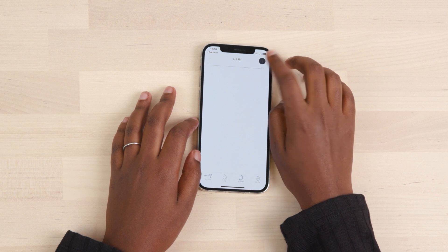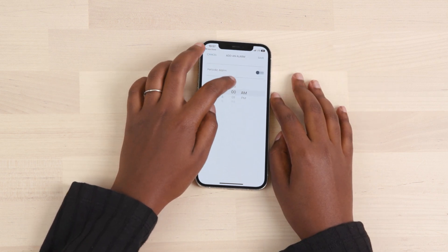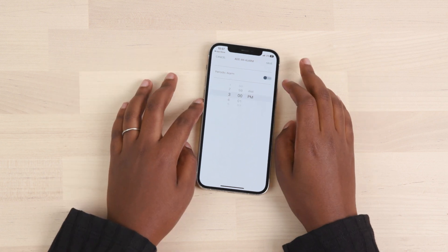Keep up with your pumping sessions by setting an alarm within the app. In the Alarm tab, you can set your alarm at a specific time or in 5-minute intervals.